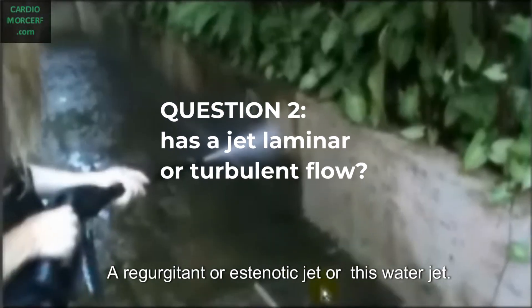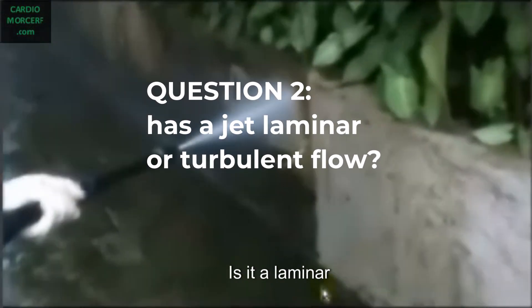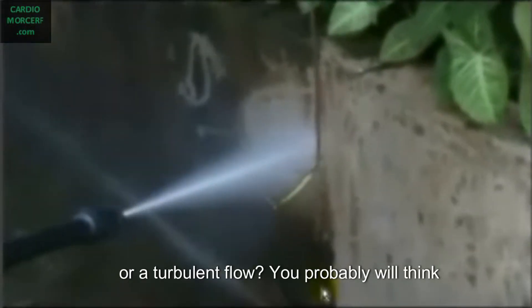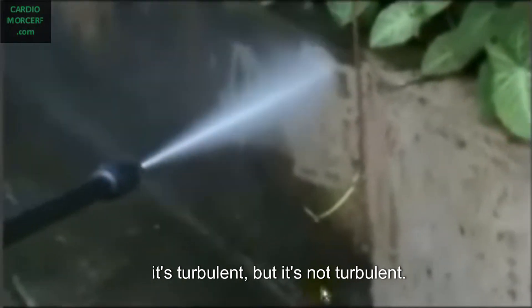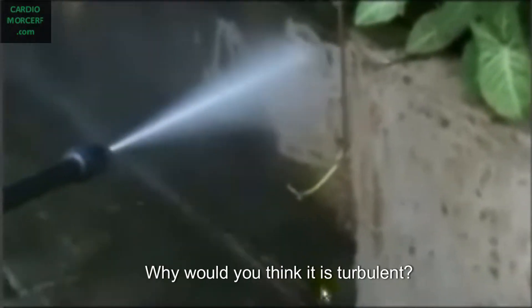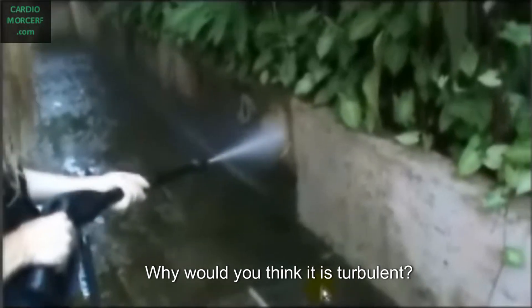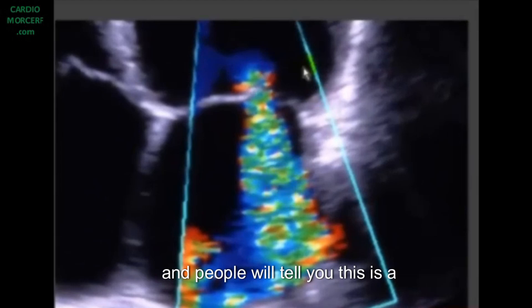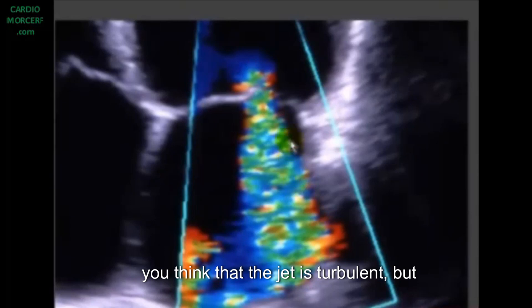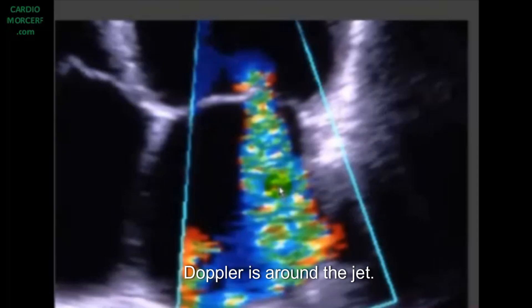Another question I make. A regurgitant or stenotic jet, has it a laminar or turbulent flow? You probably will think it's turbulent, but it's not turbulent. The jet is laminar. Why would you think it is turbulent? Probably because you've seen color Doppler, and people will tell you this is a turbulence of a mitral regurgitation. But it's not turbulent. The jet is laminar. The turbulence you are seeing in the color Doppler is around the jet. The jet itself is laminar.